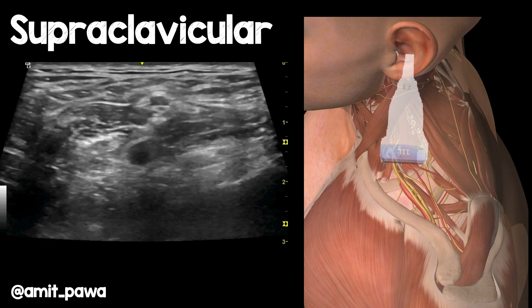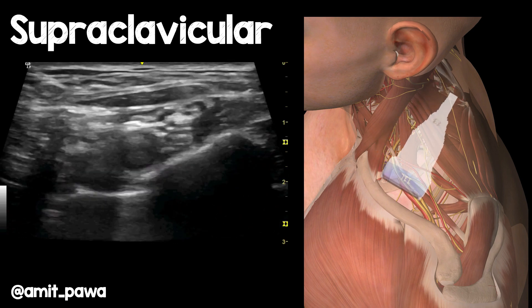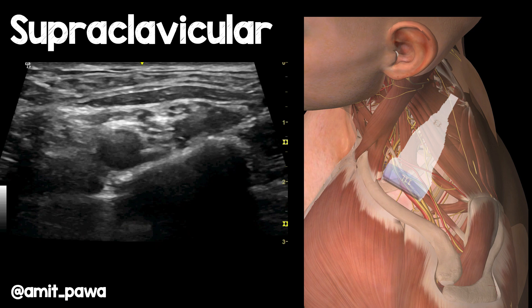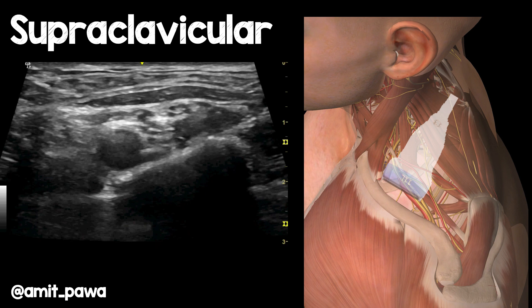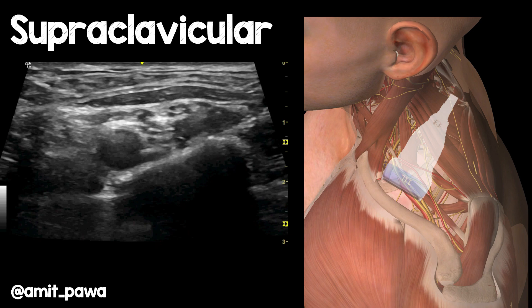As I scan anteriorly and posteriorly, this forms what I consider to be the podium sign — first place, second place, and third place for a middle podium. Going back up the neck and coming back down again, you can see that by probe movement you can alter the position that the subclavian artery takes. When we block it, we want the plexus and the artery, if possible, to be lying on that first rib. The podium view refers to the first rib being first place, the pleura anteriorly being second place, and the pleura on the right-hand side of the screen being third place — that makes me think of a middle podium.